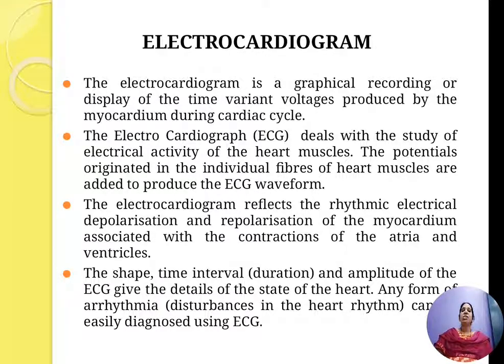The potentials originated in the individual fibers of the heart muscles are added to produce the ECG waveform.